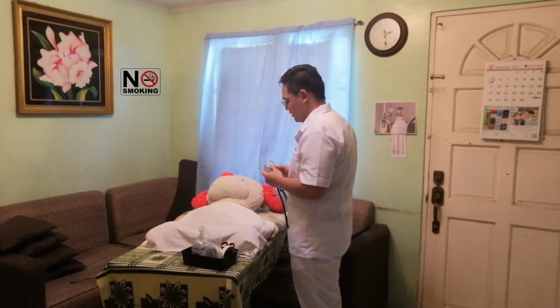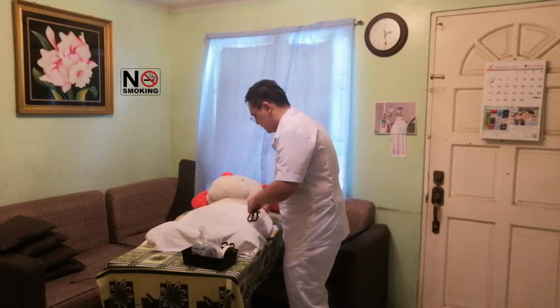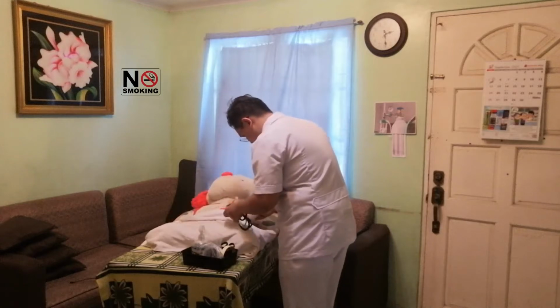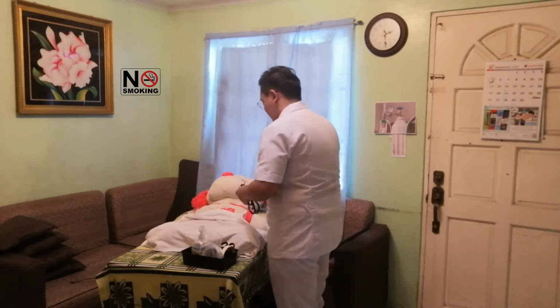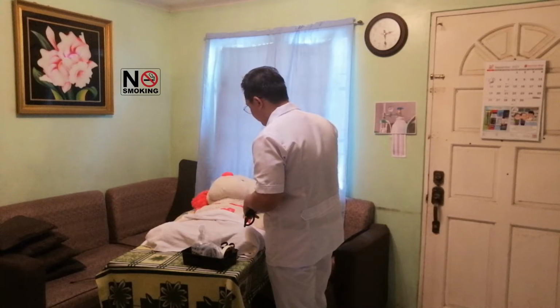So okay po. So check po muna natin yung inyong pong skin. Pwede ko po bang tanggalin po yung pong blanket? Sige po. Okay. And pwede po ba natin i-open yung mouth po natin? Okay, check ko lang po yung kulay po ng ating mucous membrane.